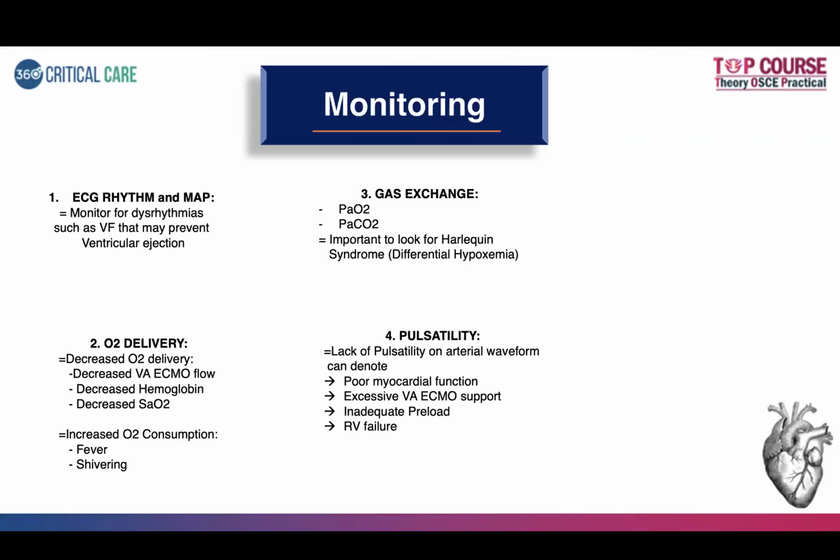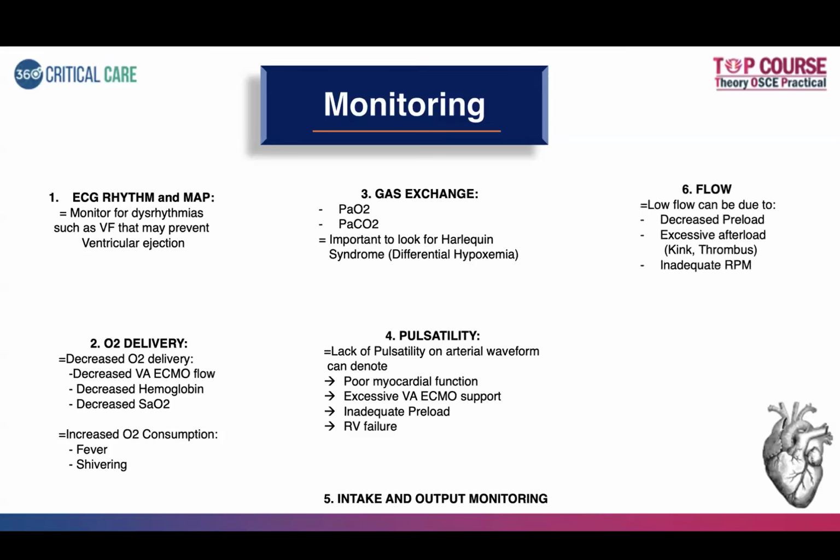Then you need to assess for pulsatility. Lack of pulsatility on the arterial waveform can denote poor myocardial function, excessive ECMO support, inadequate preload, or RV failure. So these are usually the 4 reasons for low pulsatility on an arterial waveform. Then you need to monitor the intake and output charting and flows.